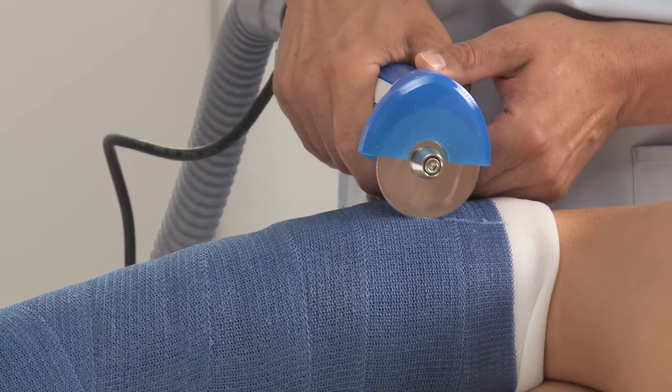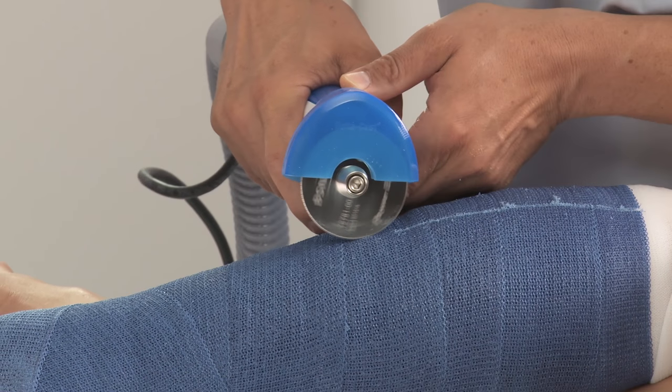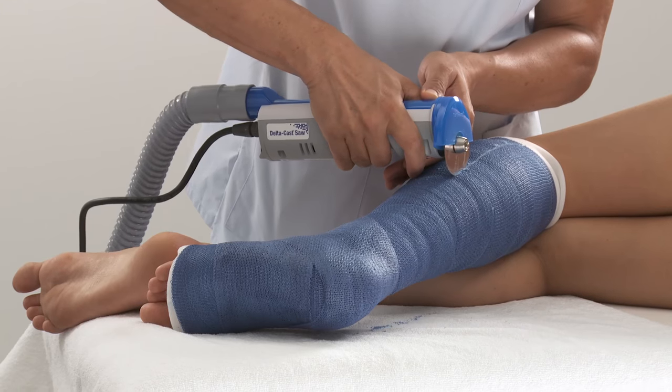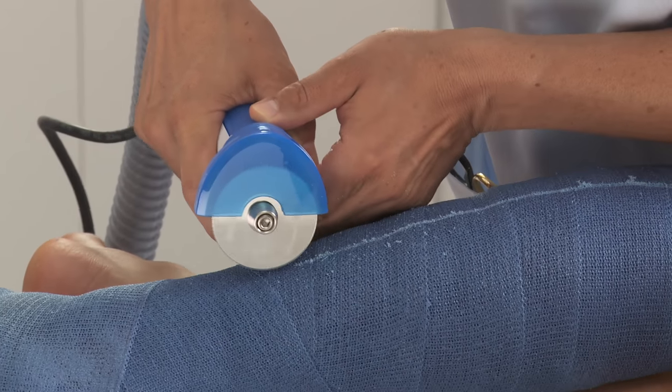With the patient now lying on his or her side, start cutting a line along the outside of the cast. Start distally, moving proximally, carefully sawing into the cast bit by bit.